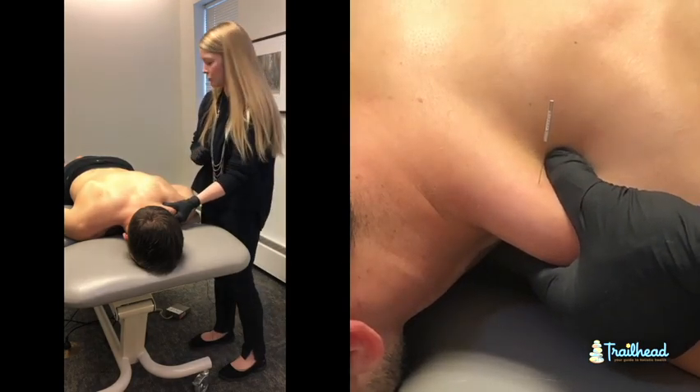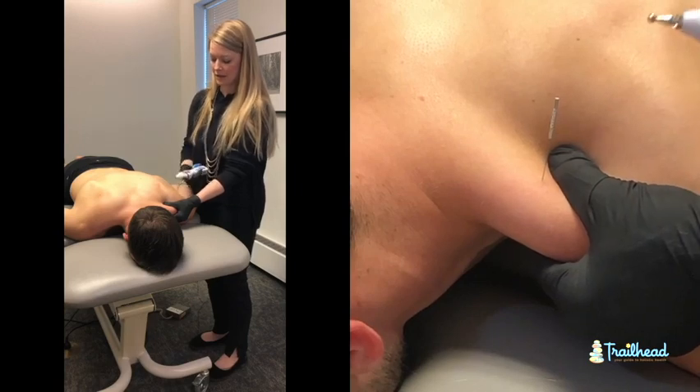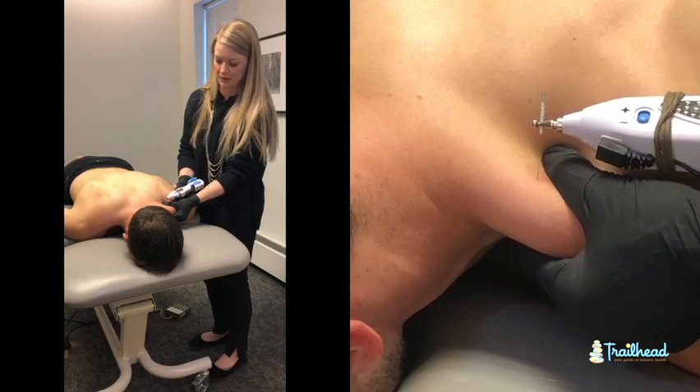Now that we have our local twitch response, we are going to go ahead and throw on some of that TENS. Mike is holding on to that ground unit so that we can run that current through. We are going to touch the end of that needle and start to slowly turn up our TENS.